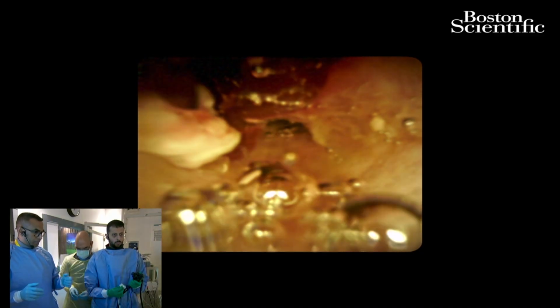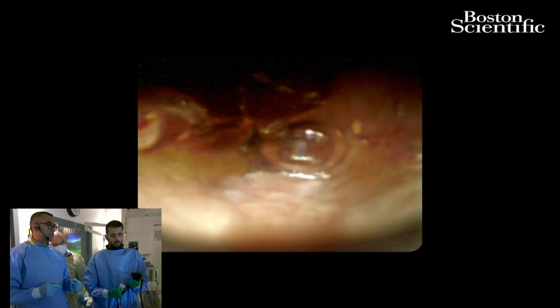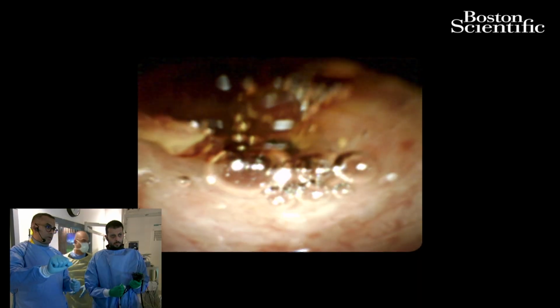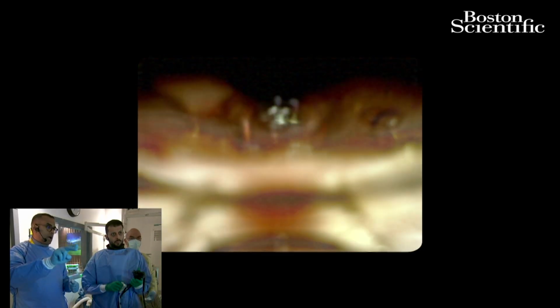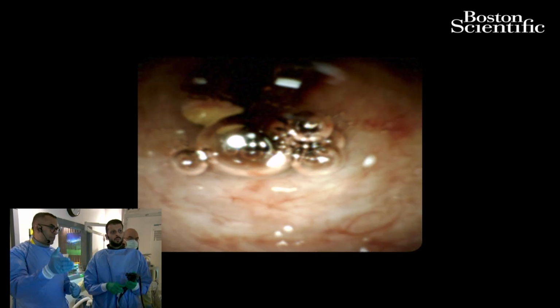But for now, back to Dr. Abid, question: the stricture here, do you think it's more malignant or benign? Because I see some blood there. Maybe it obscures the view for us, but I don't know if you have a better view. So Saad is now trying to get us a good view to help identify some of the features that would favor benign or malignant.